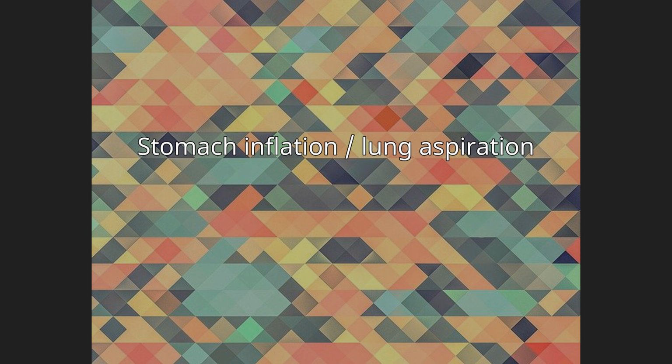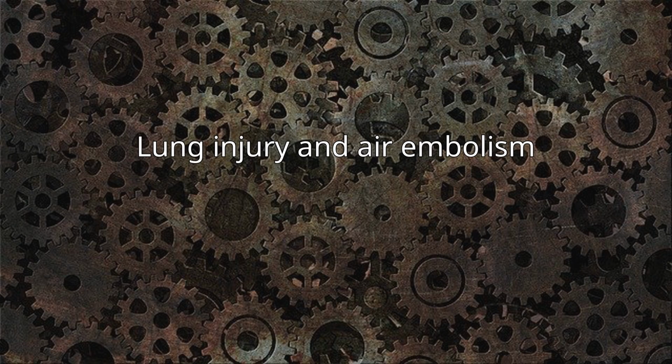Another reported complication was a case of stomach rupture caused by stomach overinflation from a manual resuscitator. The causative factors and degree of risk of inadvertent stomach inflation have been examined, with one published study revealing that during prolonged resuscitation up to 75% of air delivered to the patient may inadvertently be delivered to the stomach instead of the lungs.